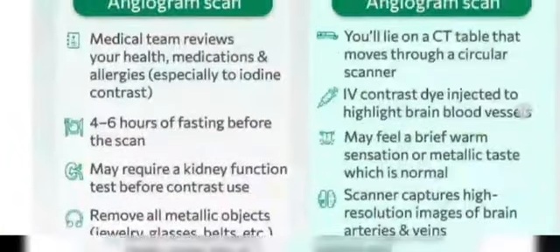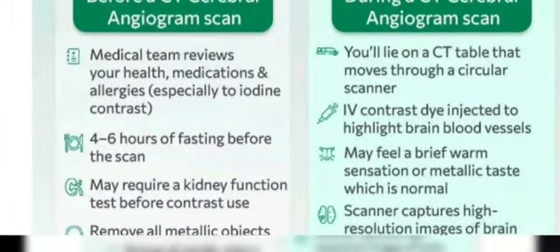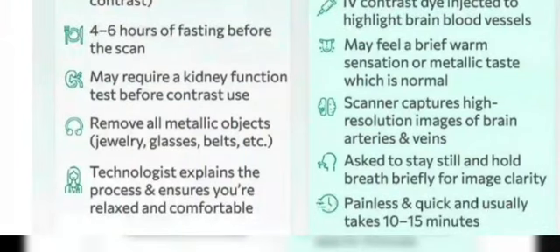So what should we look at before the cerebral angiogram? We have to review the patient's health conditions, medications, and allergies, due to the injection of the contrast. Then 4 to 6 hours of fasting before the scan. We should check that the kidney function is proper, remove all metallic objects from the patient's body, explain the procedure, and ensure that the patient is comfortable.